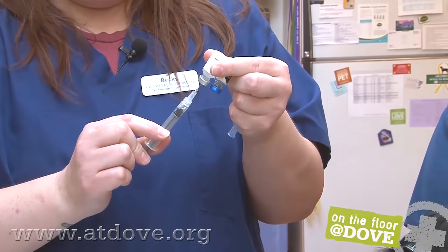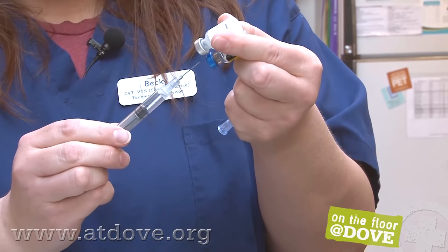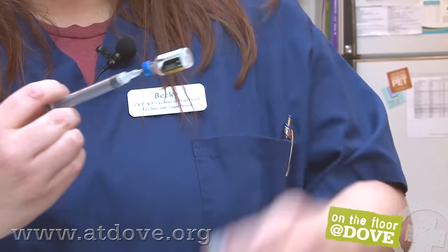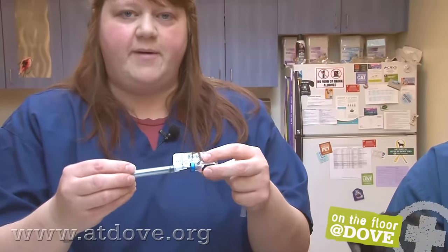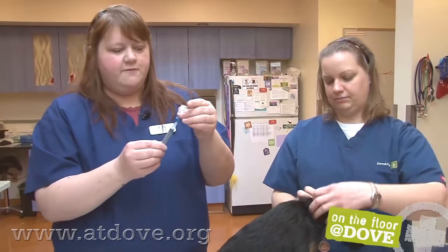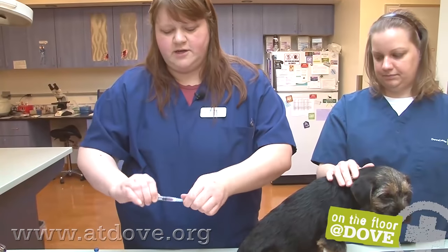Draw up all of the diluent, which is about one mil, and then inject that right into the other vial. Mix this up because you want all of it to be dissolved before you draw it back up into your syringe so there are no clumps in there. Then you're just drawing this right back up, and we always change the needle.